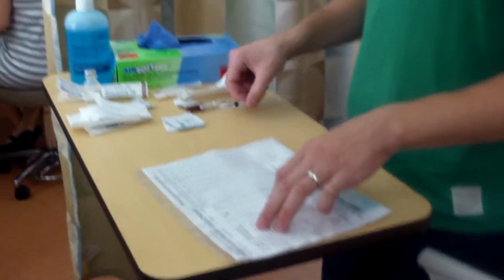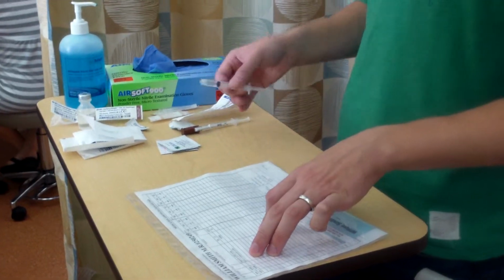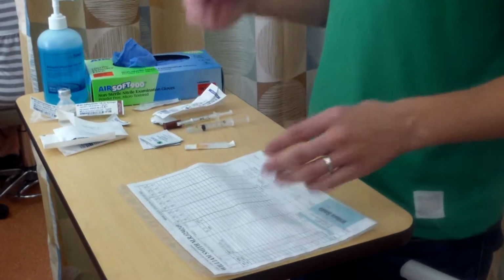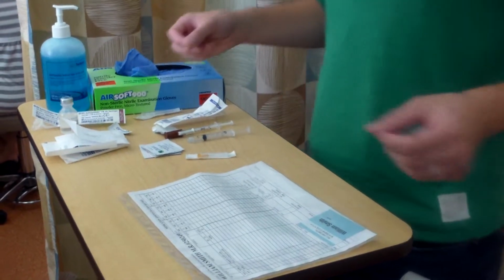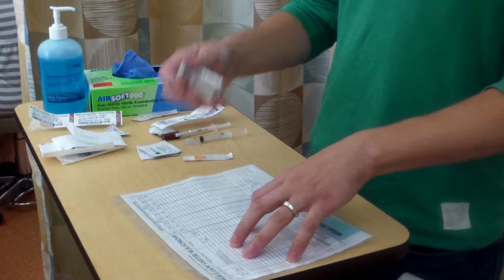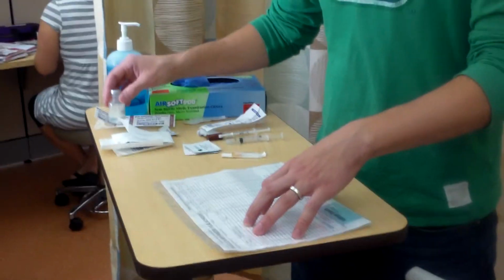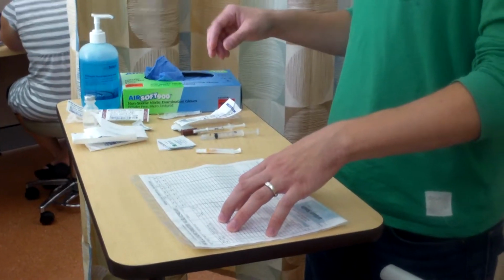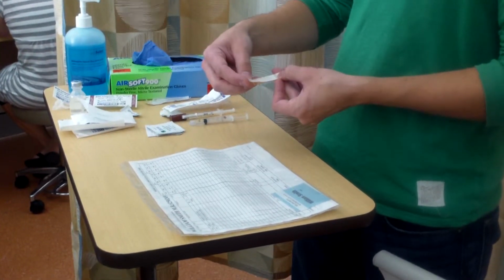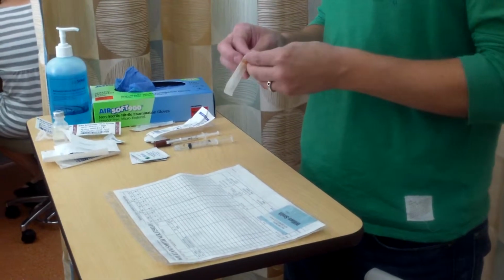So then I prepared my medication. I'll be doing my second check. Have the right amount of medication, have the right medication. And then my third check is putting away the medication. So the ampule is in the sharps glass. I'm going to check, make sure I have this one, and that's going to be going away and putting that away, and that'll be my third check. And then for my subcutaneous, I have selected a 26 gauge, 3/8 inch needle. So I'm just going to apply that.